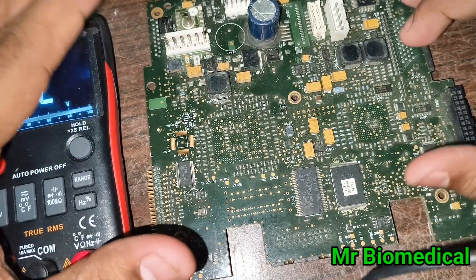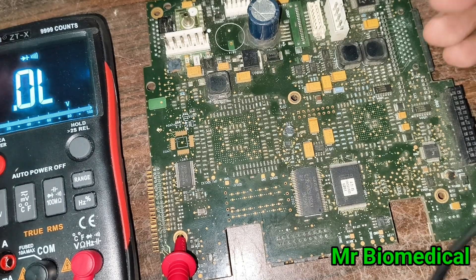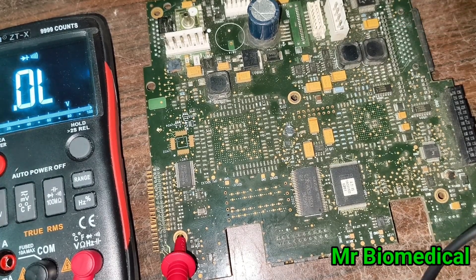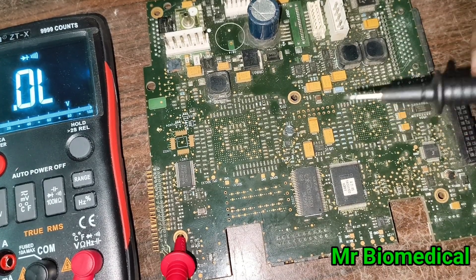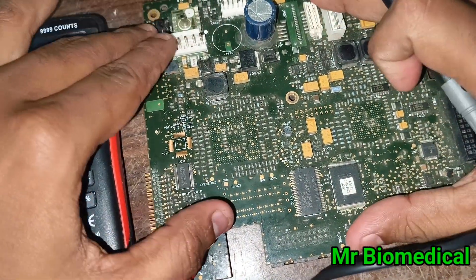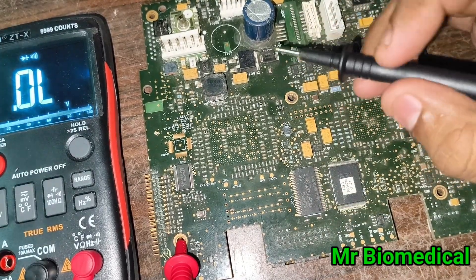If you are getting some problem with an SMT board, don't go straight to component checking first — because sometimes there will be a software issue. You can boot up with the software and it will work. If you do have a problem with the hardware section, then proceed to component inspection.